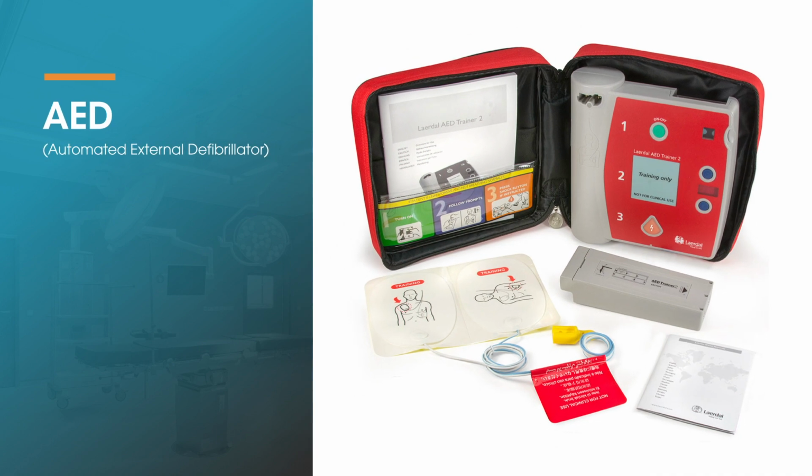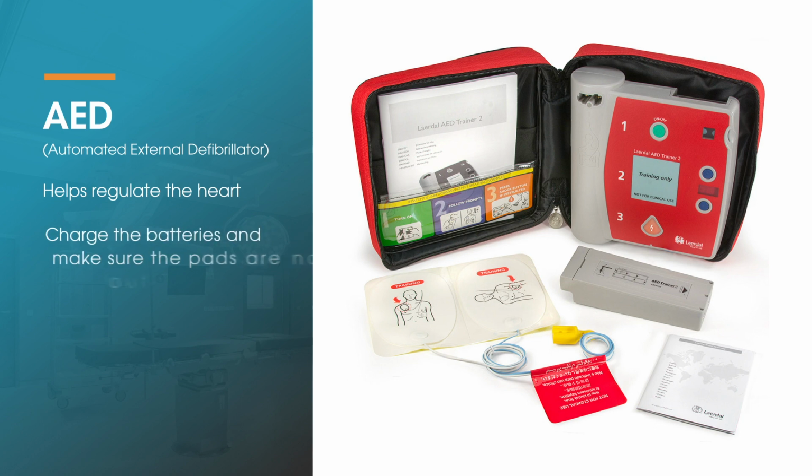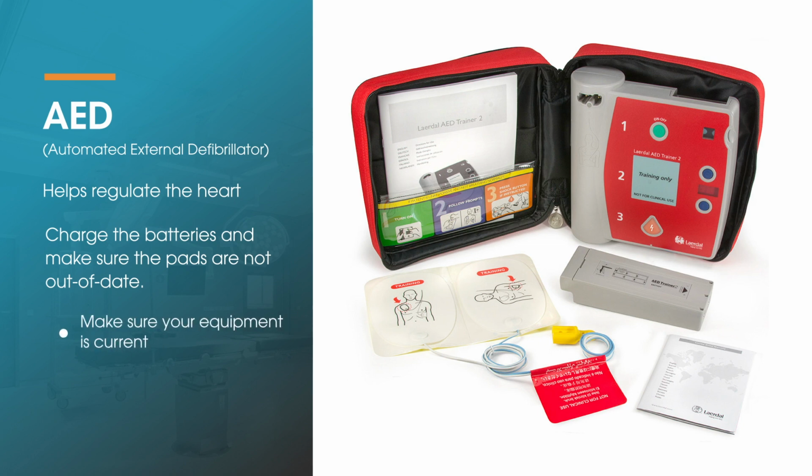The AED is super important. If someone's having some kind of heart conduction issue, the AED will check it and will regulate you. The AED only works if the battery is charged and if the pads are current. So I cannot tell you, especially after COVID, how many offices I've gone in and checked out emergency kits and everything's really old. So really make sure, check your AED. You have to, in most cases, have an adult and a child pad because you don't know who's having the emergency. It could be the kid that comes in with their parent. So you have to have supplies for multiple ages, even if you don't treat kids or you don't treat adults.